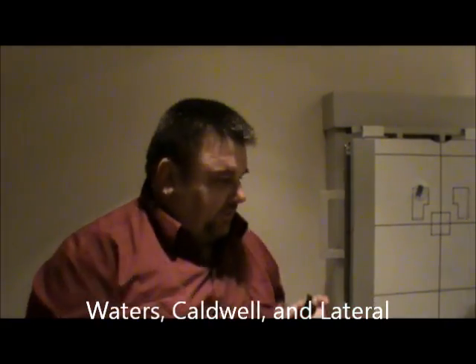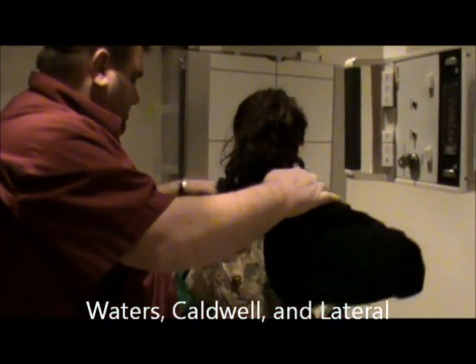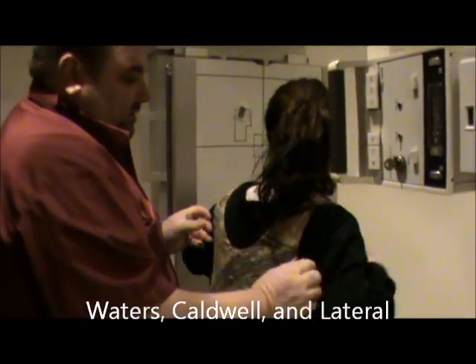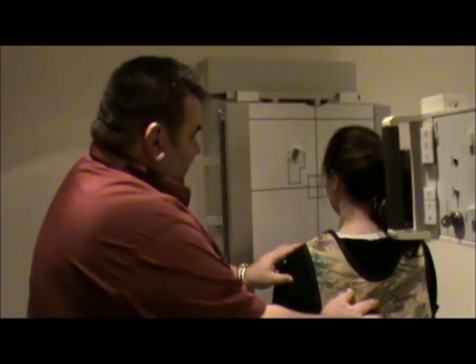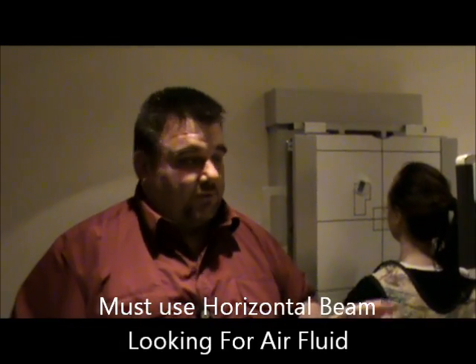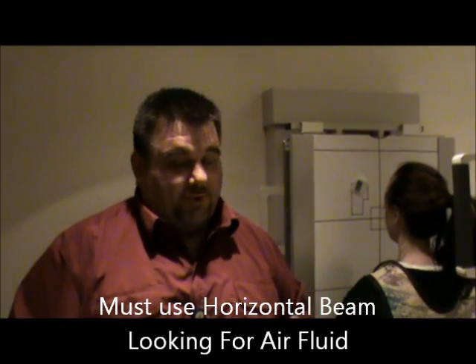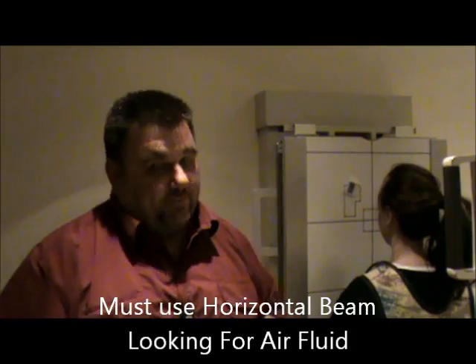We're going to place the shield to the back of the patient and have the patient stand up here. We are going to use a horizontal beam because for sinuses we're actually looking for air fluid levels. We're not going to be able to use any tube angles, so we're going to have a horizontal beam.